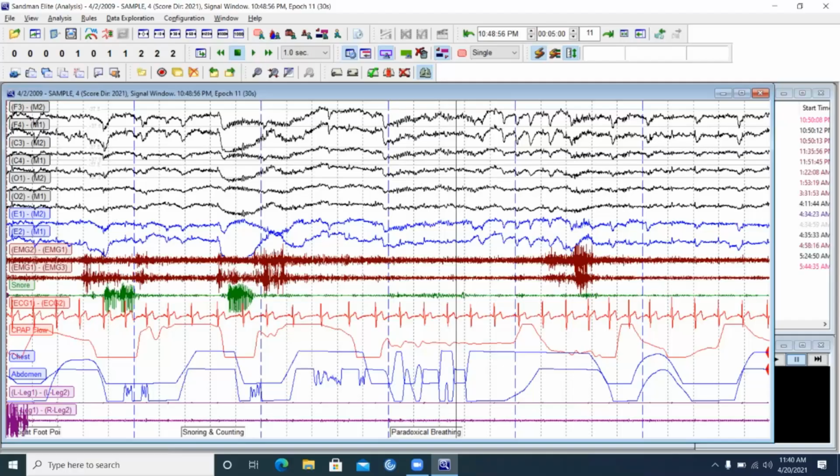So this one is the special one that you're going to have to explain. You can't just say, okay, paradoxical breathe. You can't just always read the labels. It's more for us to just tag what we're asking the patient to do, but getting down to a way of explaining it well to the patient.